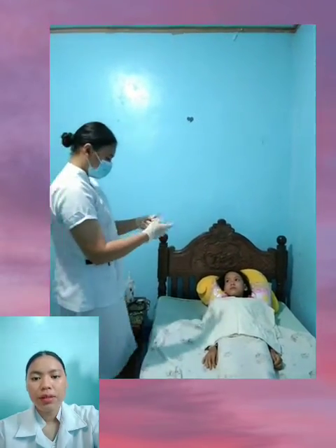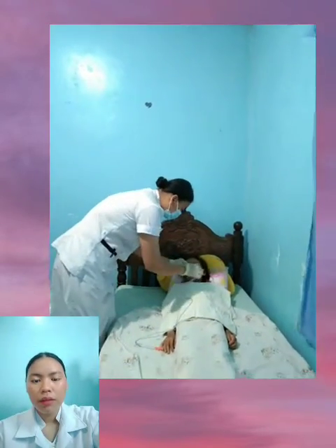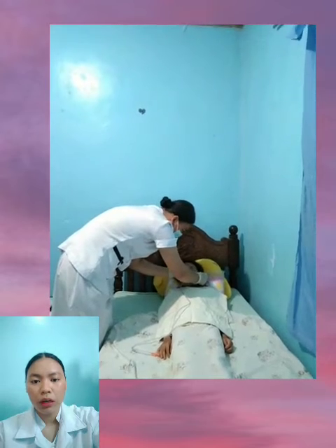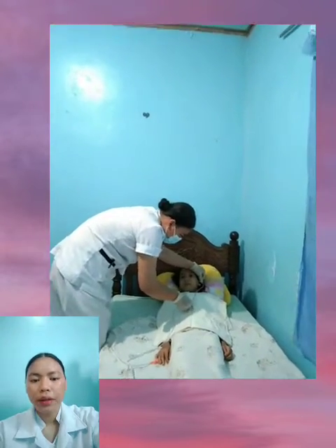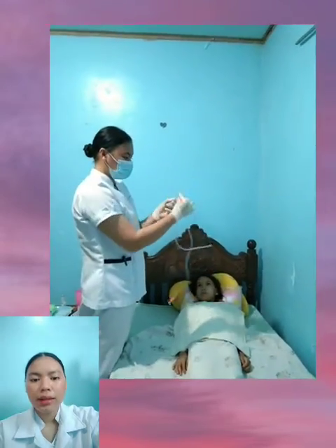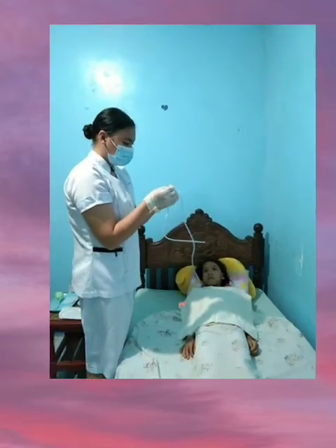Determine how far to insert the tube. Use the tube to mark off the distance from the tip of the client's nose to the tip of the earlobe, and then from the tip of the earlobe to the tip of the xiphoid. Mark this length with adhesive tape if the tube does not have markings.